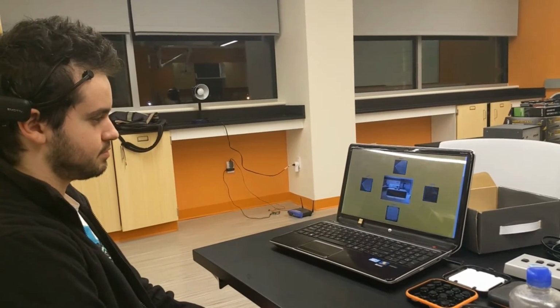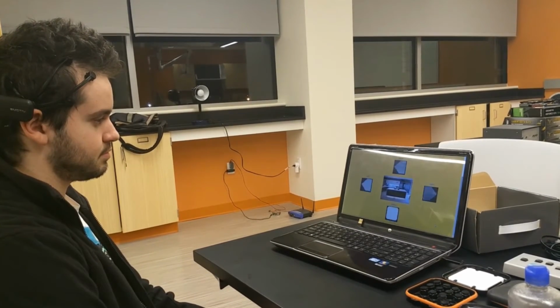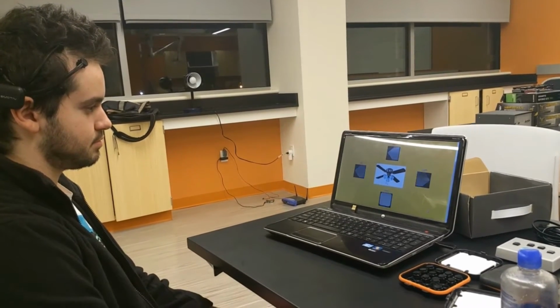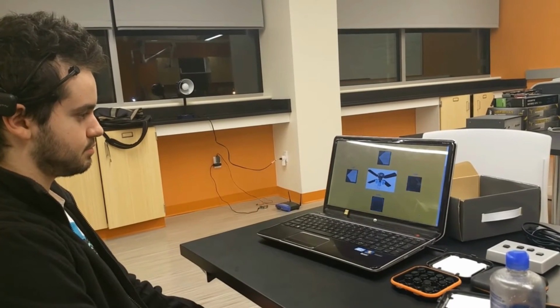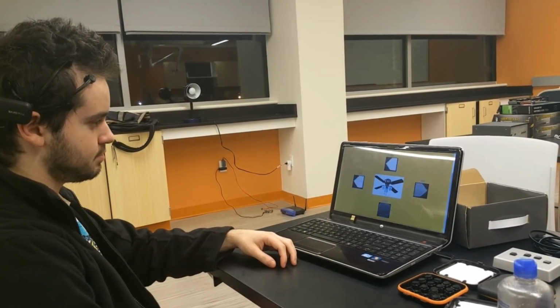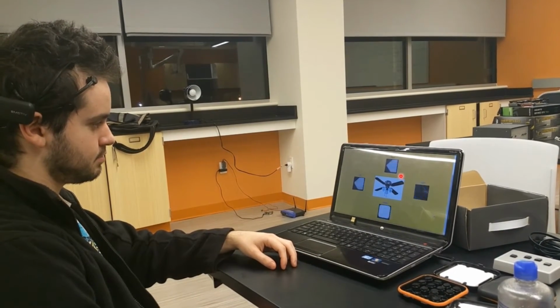Once a peak is detected, the website index is updated and a signal is sent out to an IoT device if necessary. An index was used to simultaneously change the website on all devices so users can switch on the fly on any device that has access to internet and a browser. This basic website can be expanded to control any number of devices.